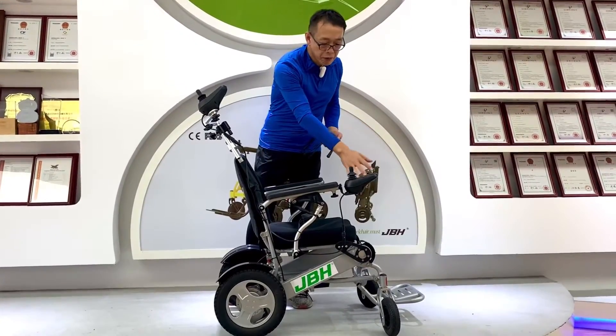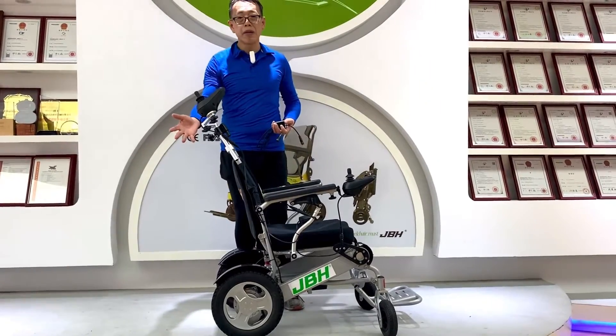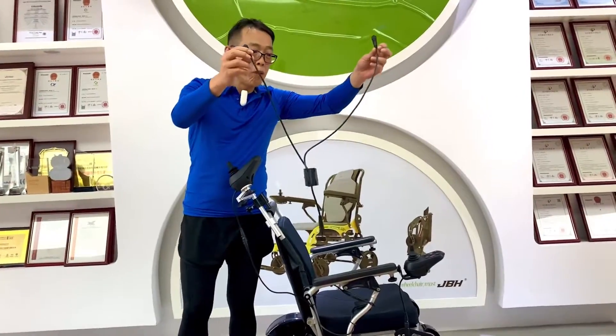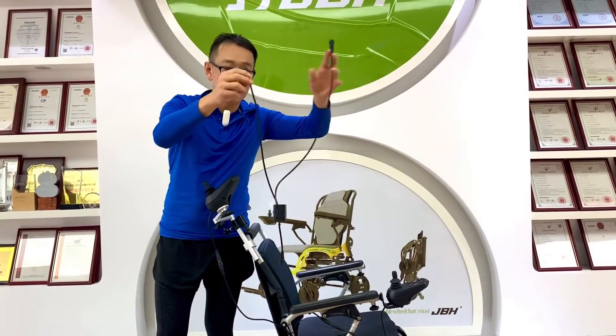You can see there is a front joystick here, and the other one for the caregiver we have already set up. This is a one-to-two cable with a switch.